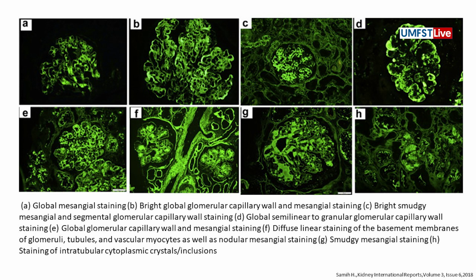And we here see mesangial staining again, and diffuse staining of the capillary loops, again smudgy-like, and there are some intracytoplasmic stainings here. I know it's not easy. We are looking, but this is just the beginning, you have to think about it.